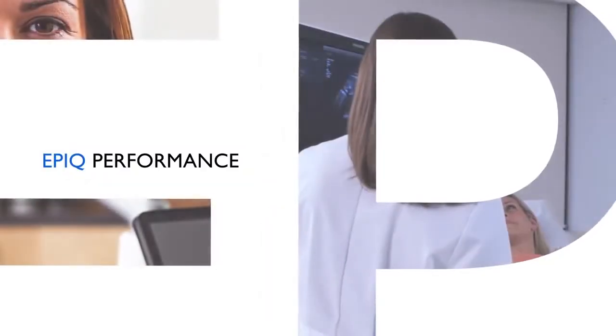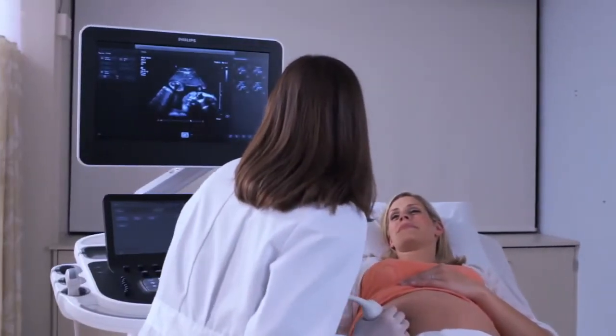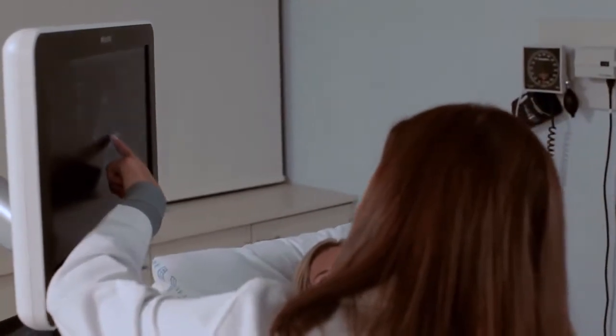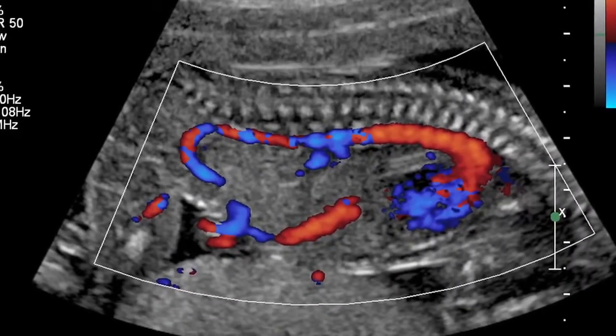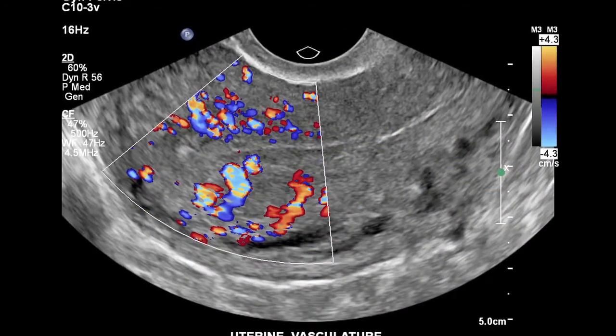The Philips proprietary Ensight imaging architecture introduces a totally new approach to forming exceptional ultrasound images. Unlike conventional systems that form the image line by line, Ensight creates images with optimal resolution down to the pixel level in real time.